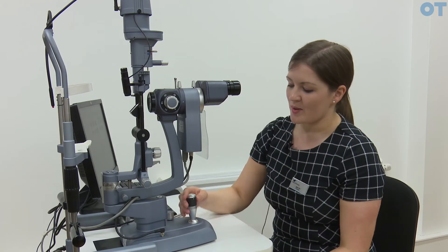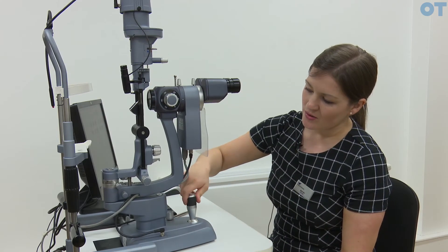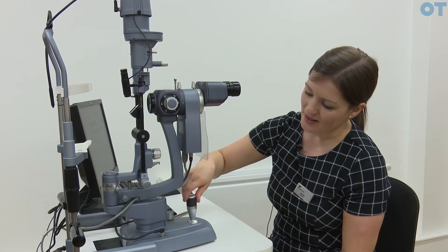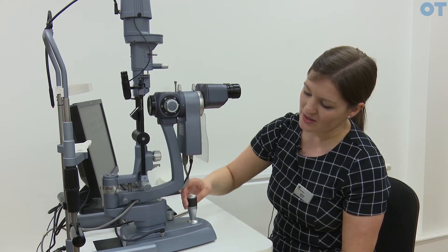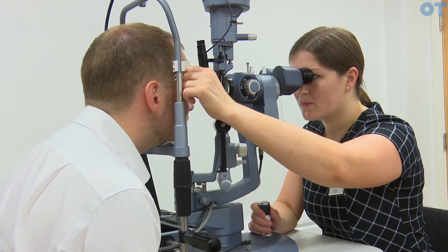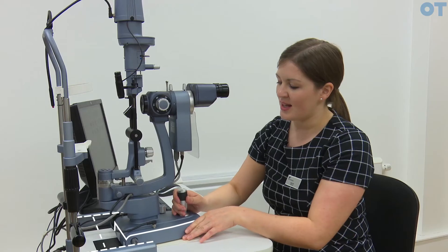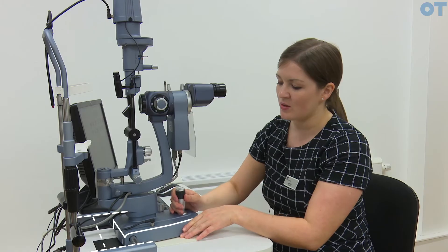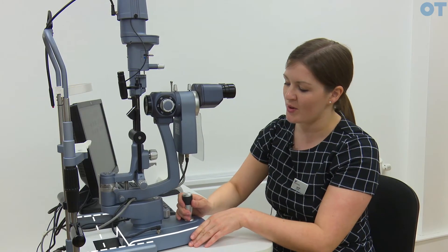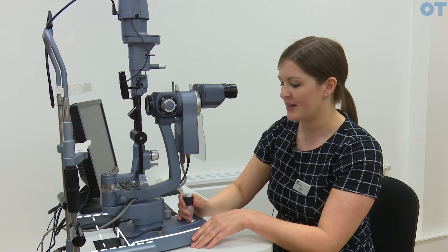The joystick can also be rotated to increase and decrease the height of the instrument. You can move laterally using the joystick for small amounts of movement, and then the slit lamp is mounted on a stand for larger amounts of movement, including moving between the eyes.